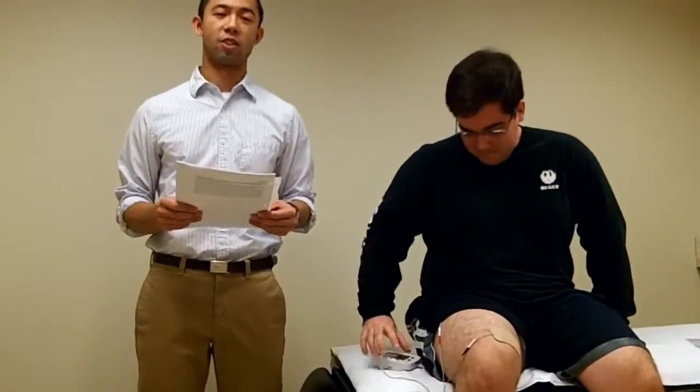My name is Richard Pine. I am a third-year physical therapy student in the Elon Physical Therapy Department, and this is a summary and brief demonstration of neuromuscular electrical stimulation.